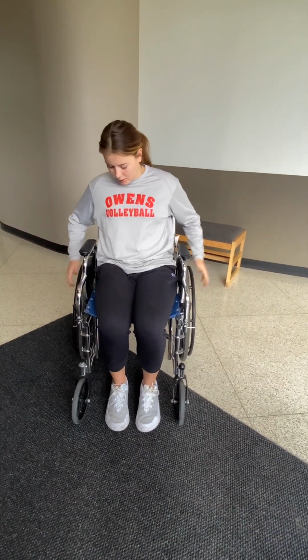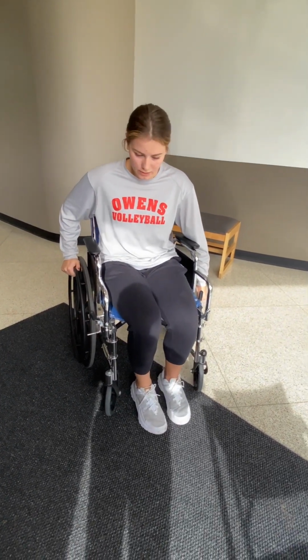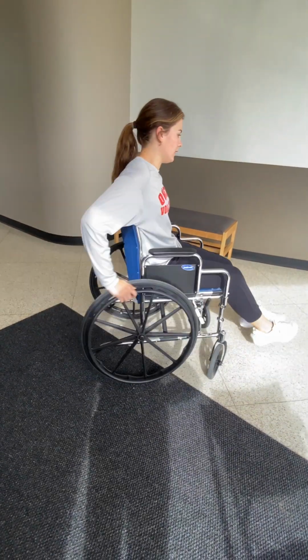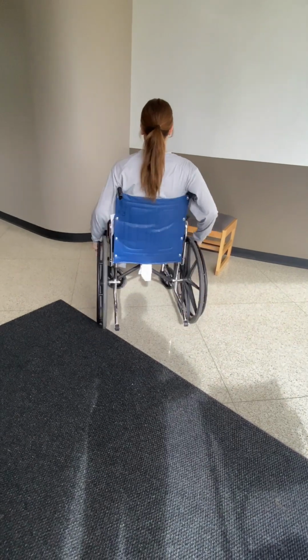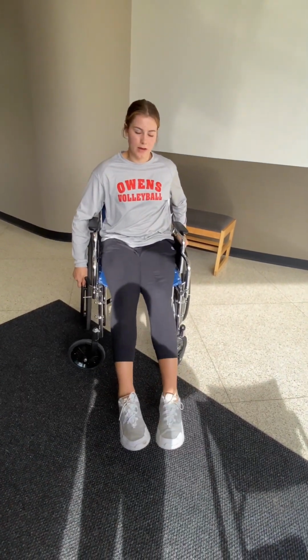Go. Now to turn in place, you're going to use your hands on the rims, and to turn to the left, you will turn the right wheel clockwise and the left wheel counterclockwise. So they go in opposite directions based on the direction you want to go. So to go left, go this way. And to go right, you do the opposite.